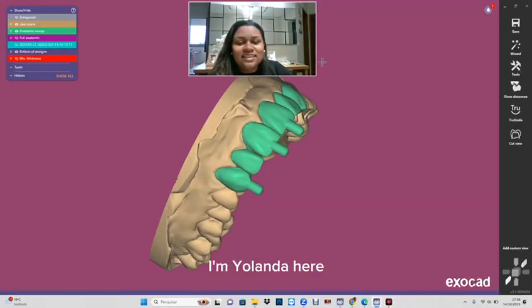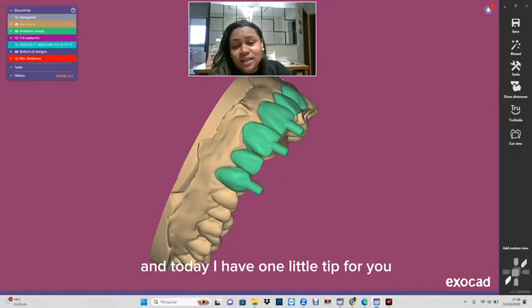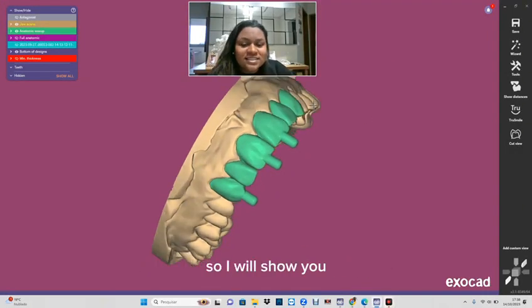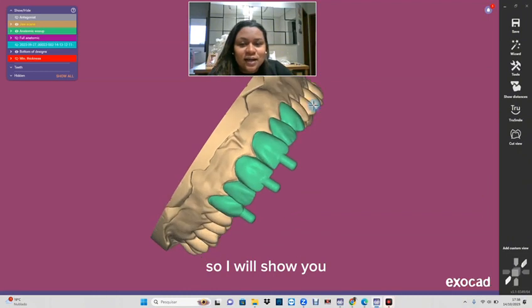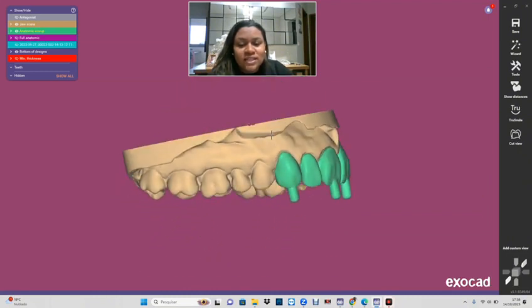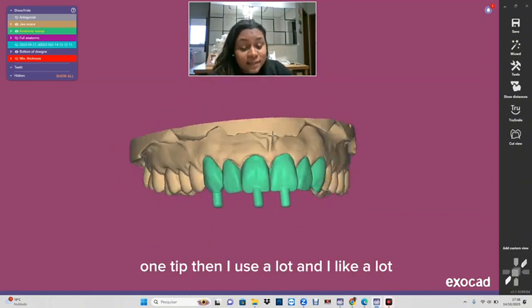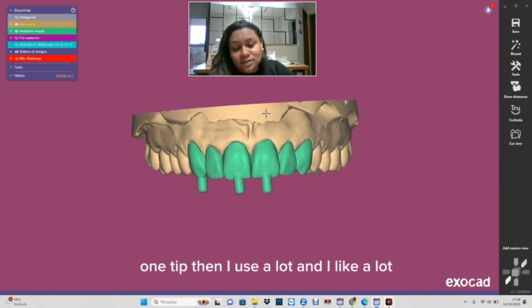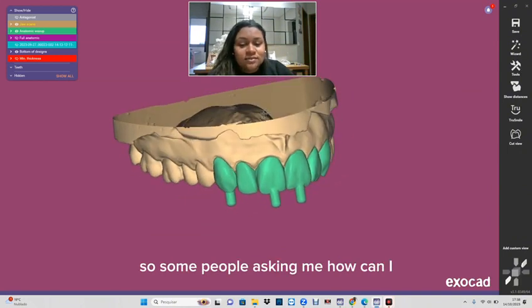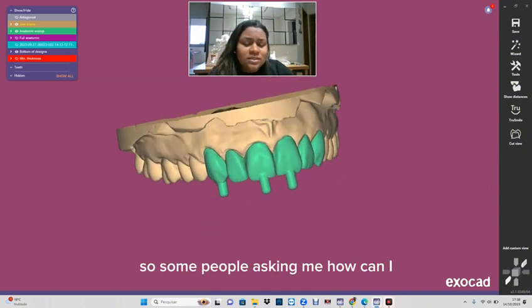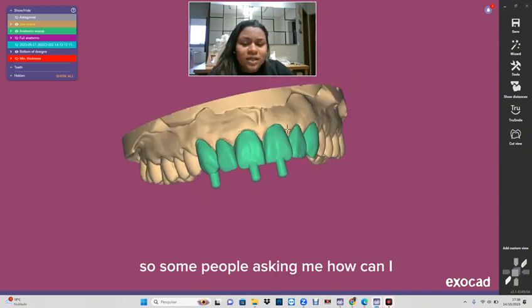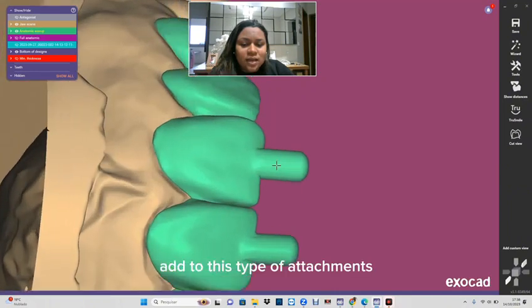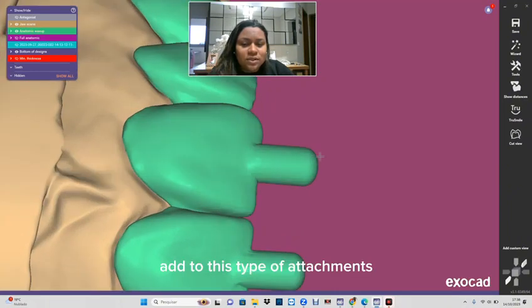Hi everyone, I'm Yolanda here and today I have one little tip for you. I will show you a tip that I use a lot and I like a lot. Some people are asking me how can I add this type of attachment in my veneers or crowns in my project, so I will show you in this video.